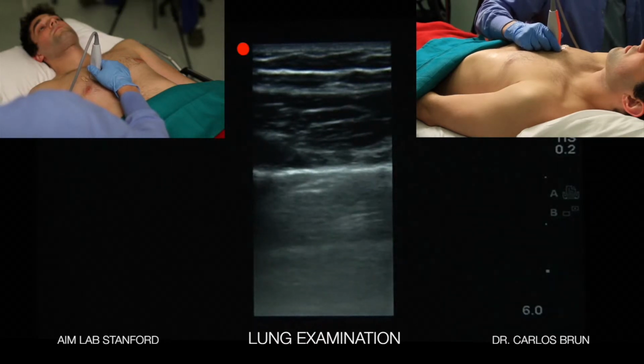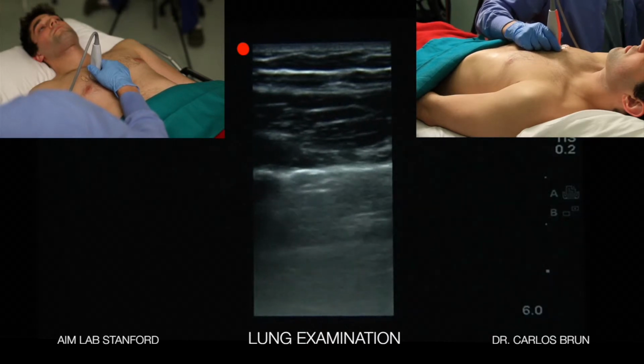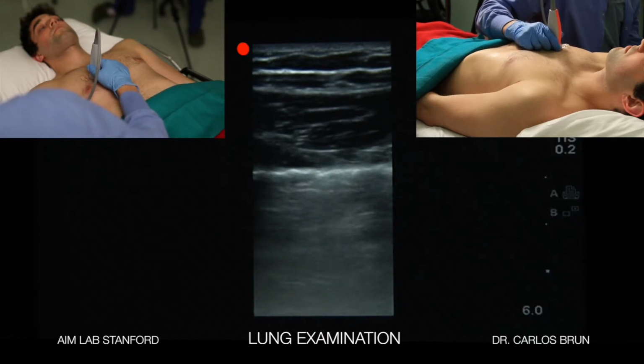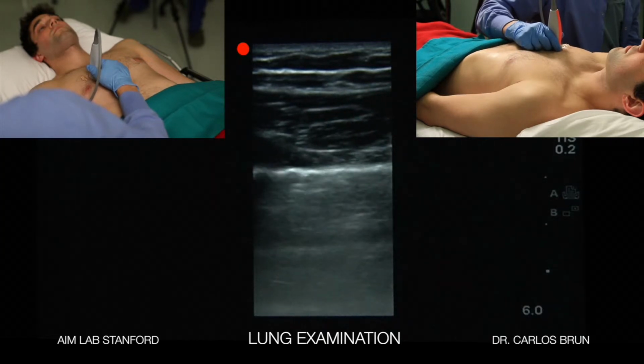This can be indicative possibly of consolidation or inflammation, and so that may be a tethered lung to the pleural surface, and you may not have movement. Another potential pitfall could be that you have a bleb. And then, of course, what we're looking for would be pneumothorax. So you may not see a clearly moving line with pneumothorax.